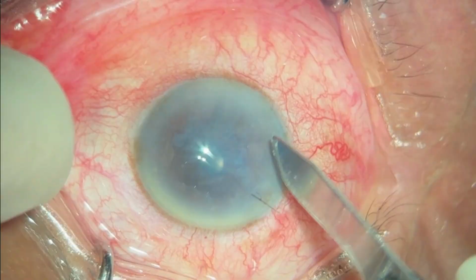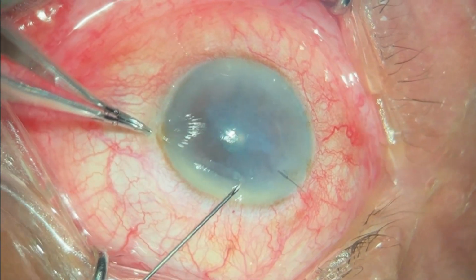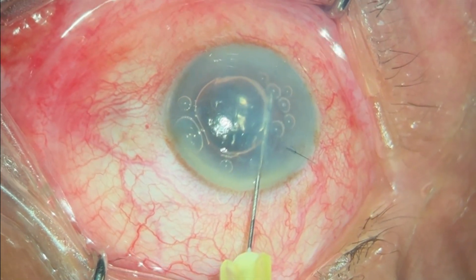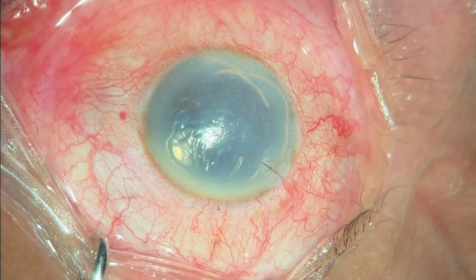So I decided to take the patient for air injection. I began by debriding the epithelium to get better visualization of the AC. With a 30 gauge needle, I injected full chamber air, and the AC was well pressurized.